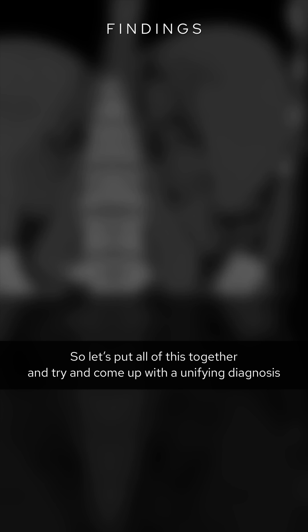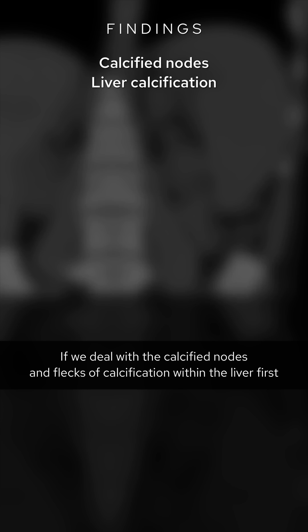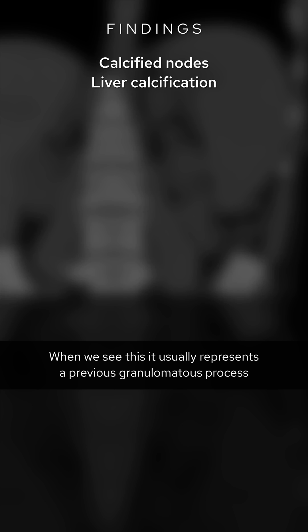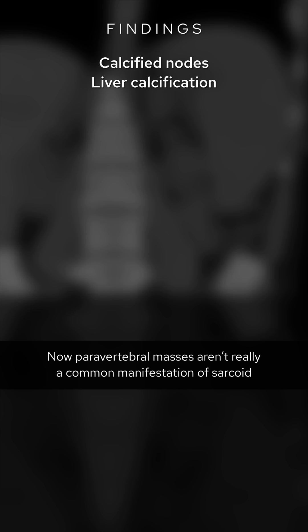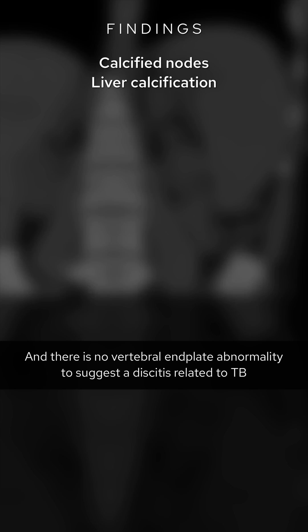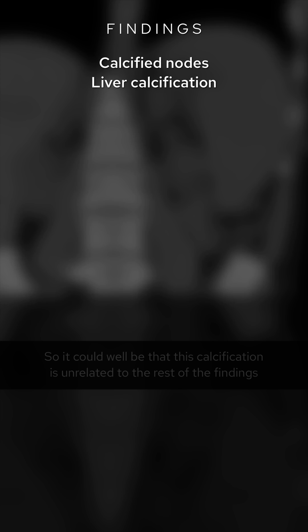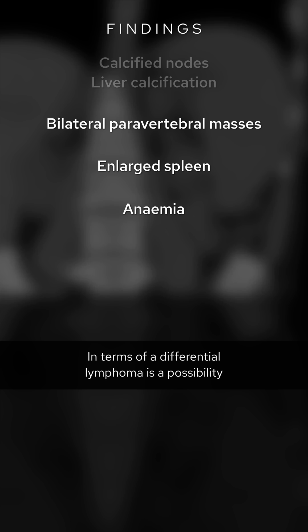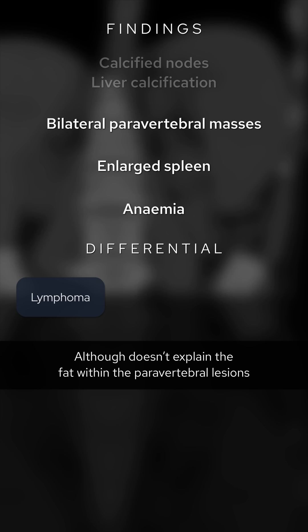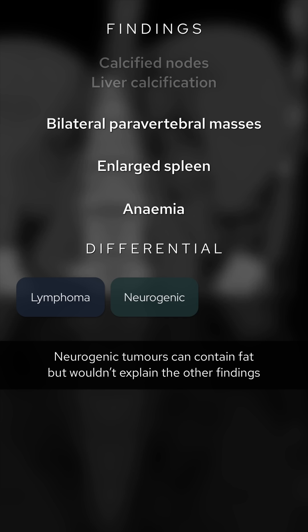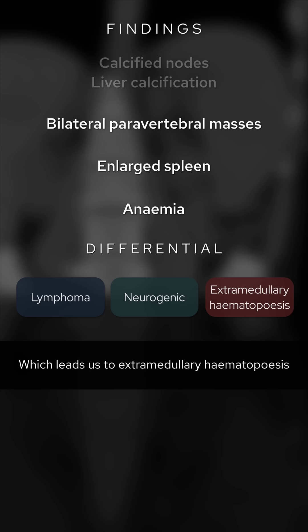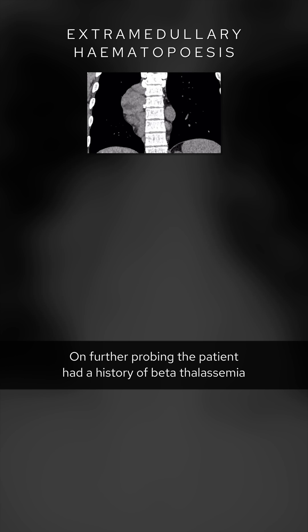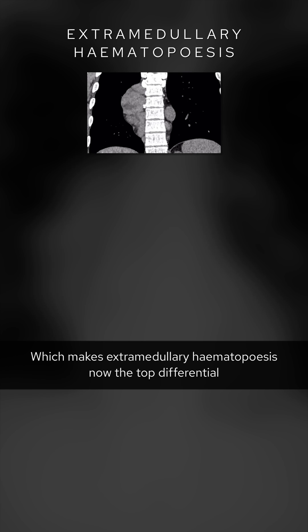Let's put all of this together and try to come up with a unifying diagnosis. Dealing with the calcified nodes and flecks of calcification within the liver first — when we see this it usually represents a previous granulomatous process, such as sarcoid or previous infection including TB and histoplasmosis. Paravertebral masses aren't a common manifestation of sarcoid, and there is no vertebral end plate abnormality to suggest a discitis related to TB, so this calcification could be unrelated to the rest of the findings. Otherwise we have bilateral fat-containing paravertebral masses, an enlarged spleen, and possible anemia. Lymphoma is a possibility but doesn't explain the fat within the paravertebral lesions. Neurogenic tumors can contain fat but wouldn't explain the other findings, which leads us to extramedullary hematopoiesis. On further probing, the patient had a history of beta thalassemia, which makes extramedullary hematopoiesis now the top differential.